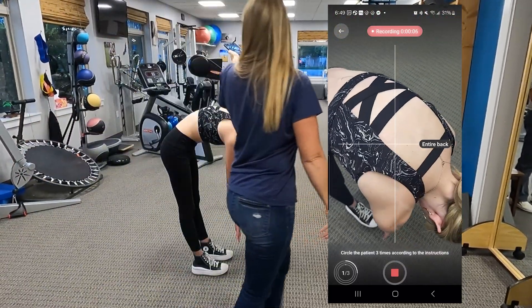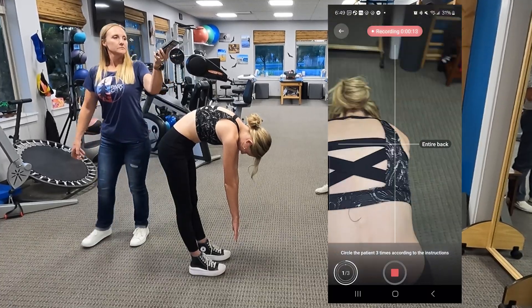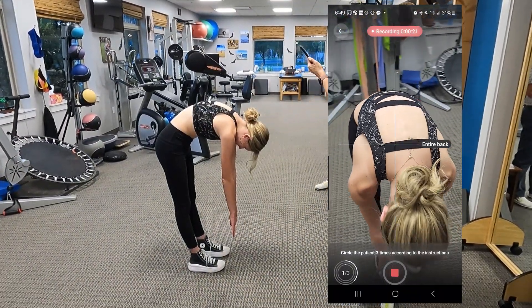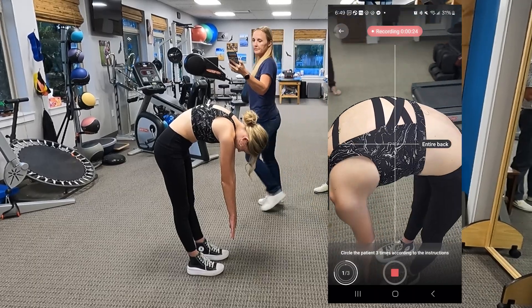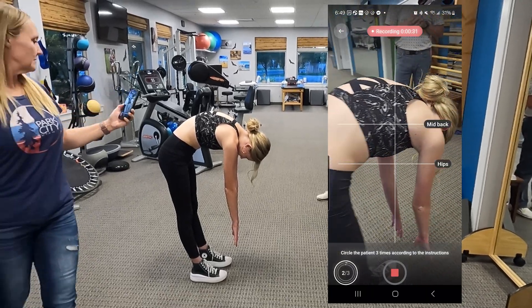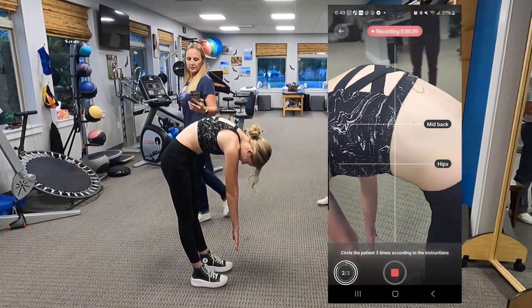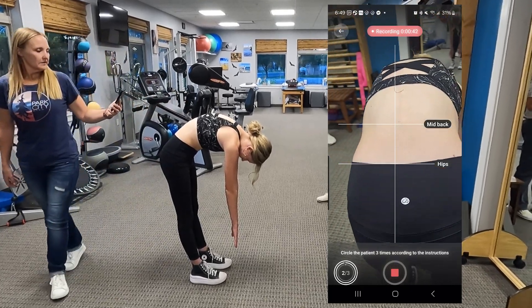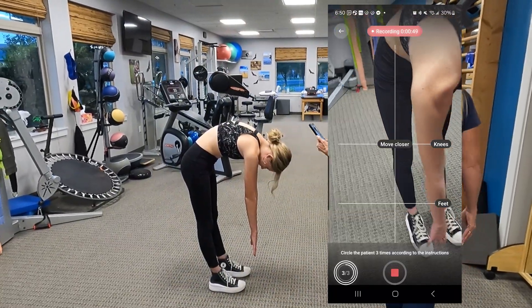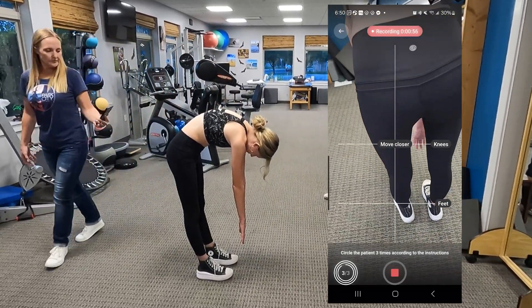One concern I have with this position is if you had back pain and had to hang out like this for a while, it may not be the most comfortable position. But to get an accurate measurement and an AI prediction of your scoliosis Cobb angle, it needs both the standing and the bent-over position. The app will tell you whether to move forward or back. Addie, how would that feel if you had back pain being down there that long? It wouldn't feel very good.